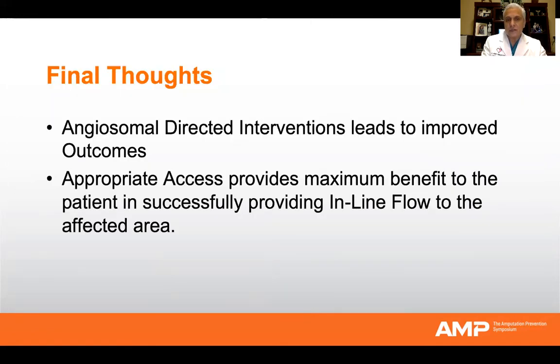So in conclusion, angiosomal directed interventions lead to improved outcomes. It has been shown many, many times. Appropriate access provides maximum benefit to the patient in successfully crossing the lesion and providing direct inline flow to the affected area. Thank you very much.